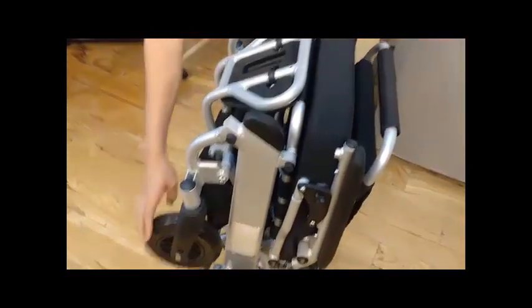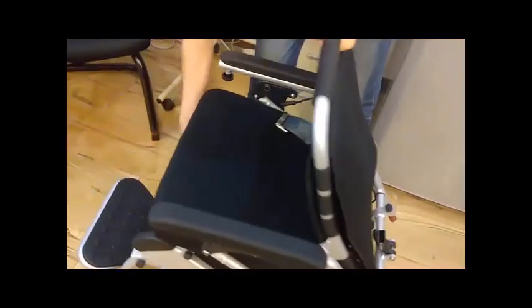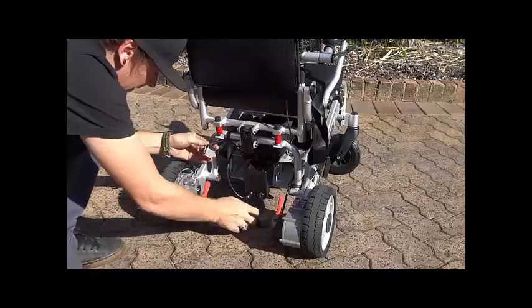We also include a widening kit should you need a bit more space between the armrests. This kit increases the distance between armrests to 54cm or 21 inches, up from 43cm or 16.9 inches.